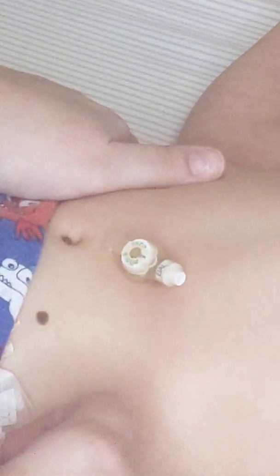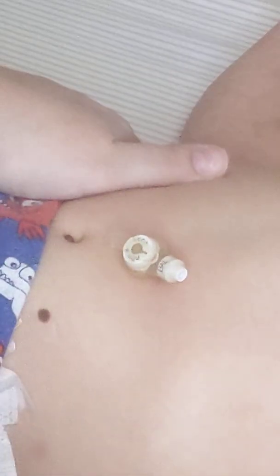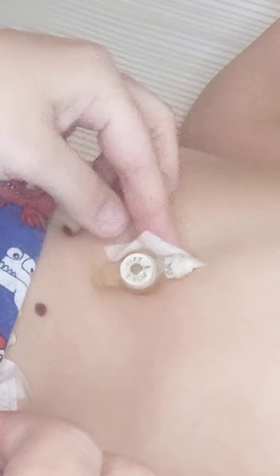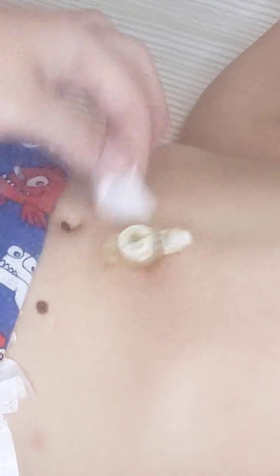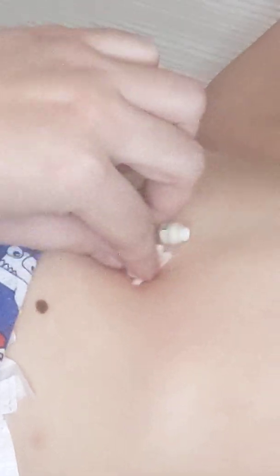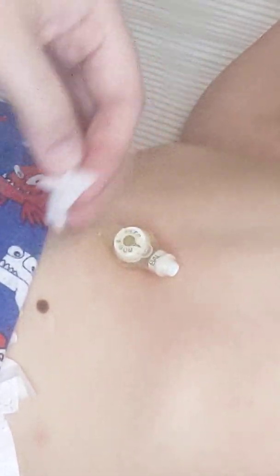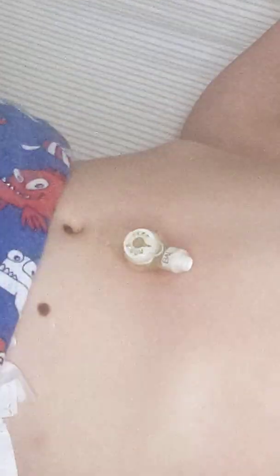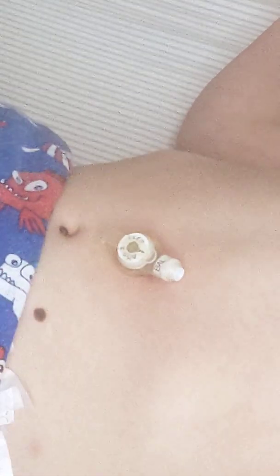He was getting a lot of granulation tissue, they call it, and his skin just didn't look good. So I discontinued using those, and his site has always looked beautiful. I always get compliments. I kind of think that the T-sponge in a way holds bacteria and that drainage at the area, and that's what sometimes causes a lot of complications. Just my thoughts, because once I discontinued using them, his site got a lot better. Now all I really need to do most of the time for care is take a baby wipe, clean around it really well, and then he's good to go.